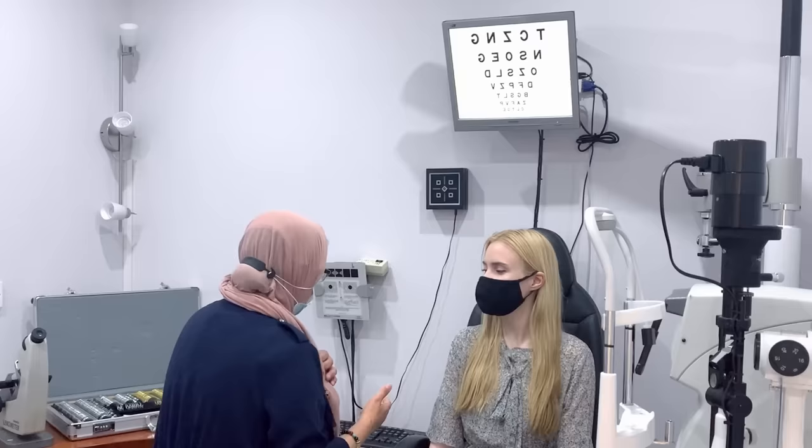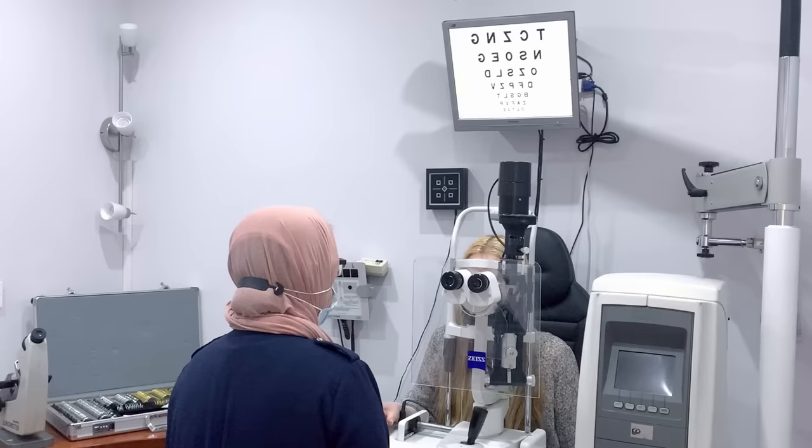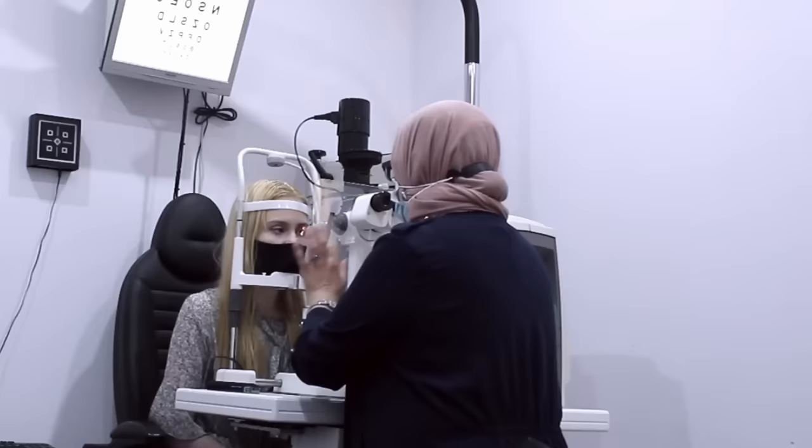Yeah, thank you. So what we're now going to move on to is looking at the front of the eye. Okay, so I'm going to use this machine. Again, everything's been cleaned from the last patient. So I'm going to get you to put your chin on that rest. Forehead against the bar. Pull your forehead forward as well. That's it. And it's just light, okay? It doesn't hurt, yeah? And I've got a screen in front of you as well. So I'm not going to touch you. And I will put my gloves on if we need to, okay?